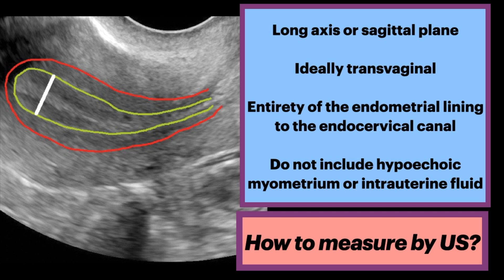This sagittal endovaginal ultrasound shows a female during the late proliferative phase of her menstrual cycle. There are three hyperechoic longitudinal lines separated by the hypoechoic endometrium, outlined in yellow, surrounded by the junctional zone, outlined in red, which appears as a subendometrial hypoechoic line. The white line represents endometrial thickness.